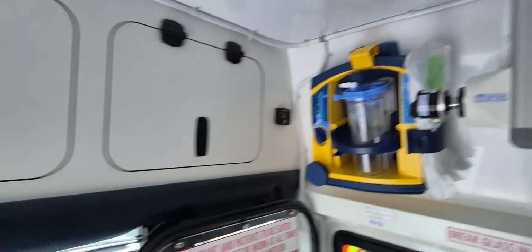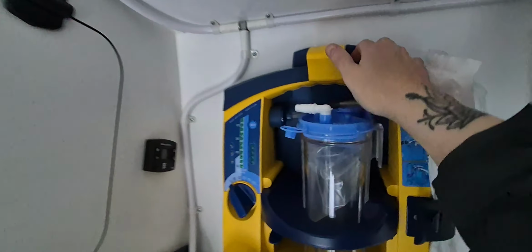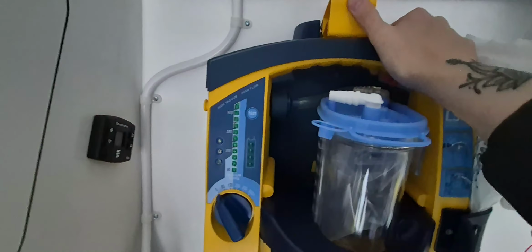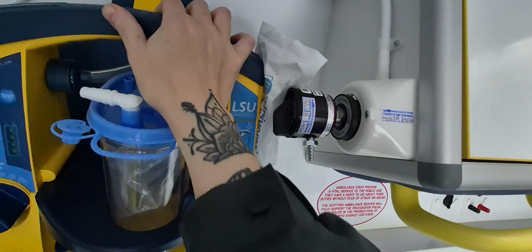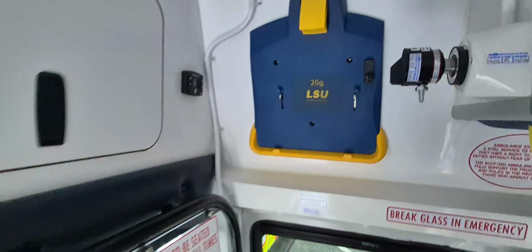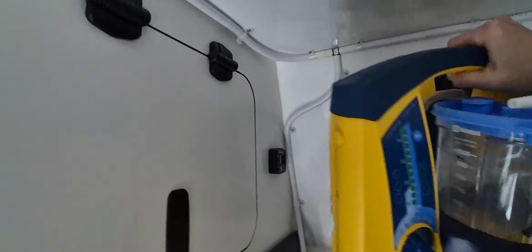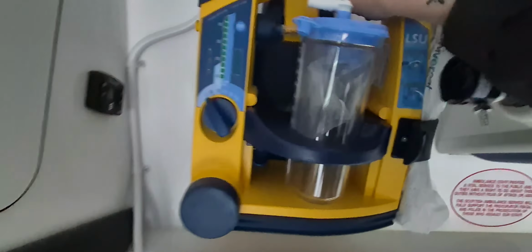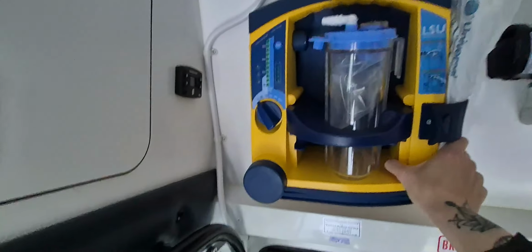For the majority of you, your suction kit will be located up at the top right of your vehicle, and to remove it just lift this and pull it out. It'll probably stick on your oxygen point there, and then just lift it out. To get it back in, it's just the reverse. Making sure that you're tweaking it behind there, seating it in, lifting this tab here, and it should just click like so. That's it in nice and secure.